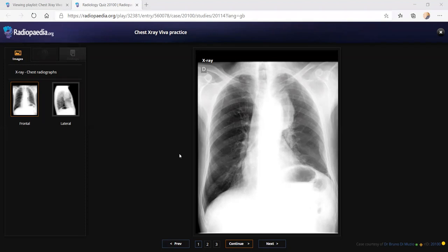Yeah, the previous radiograph one year before was almost the same. So that suggests that it's a stable lesion, which is most likely a benign entity. To inform the findings to the referring clinician, my possibility will be a probably benign mediastinal lesion, most likely something like a bronchogenic cyst or a healed infective etiology.